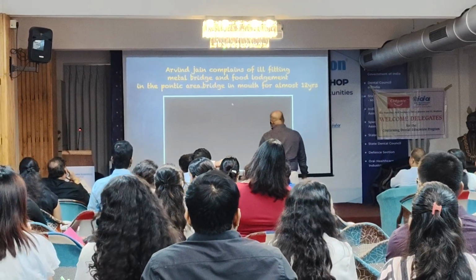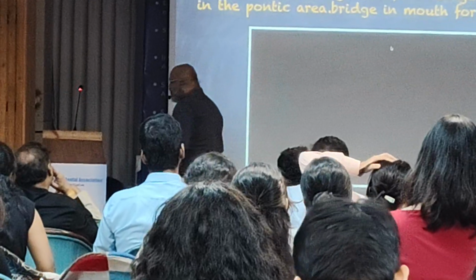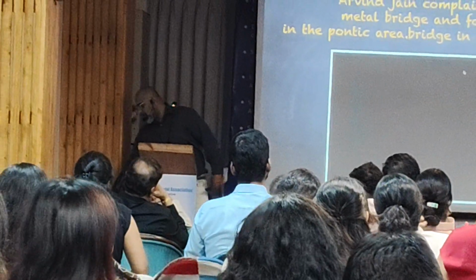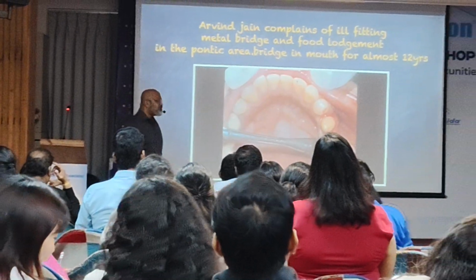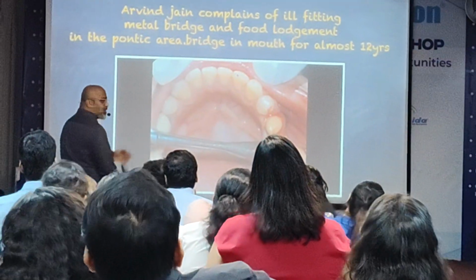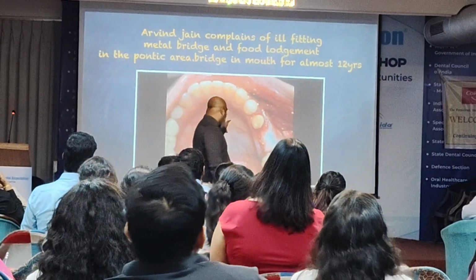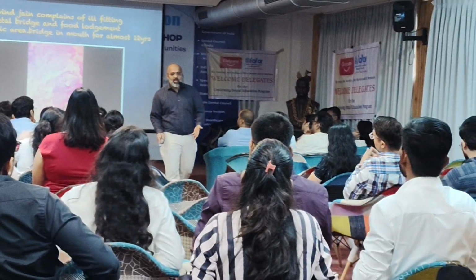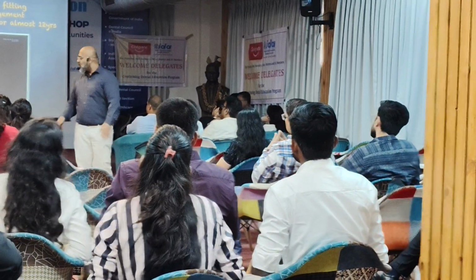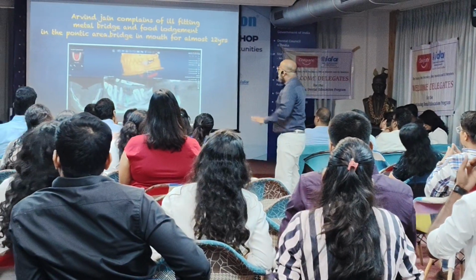So again, another case, the patient was complaining of a missing molar, bone loss. So what we had to do was use a graft which is a membrane thing. I do a lot of research also. But a graft where we don't have to use a membrane. This is an exact case of digitalization.